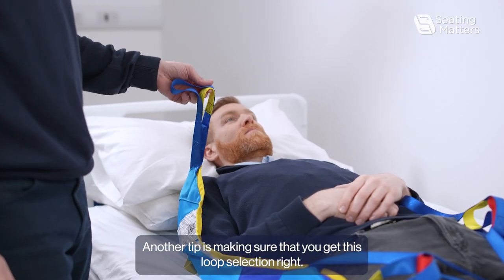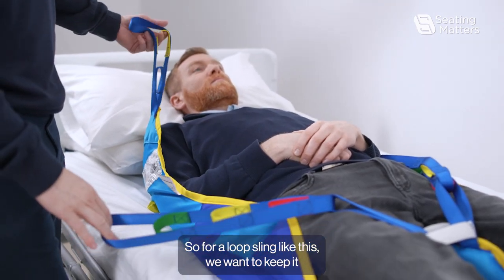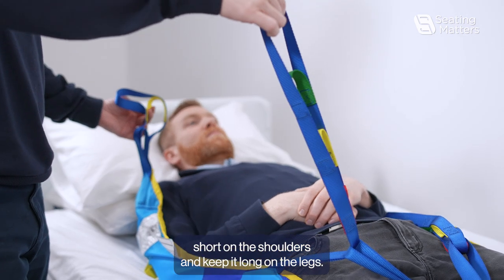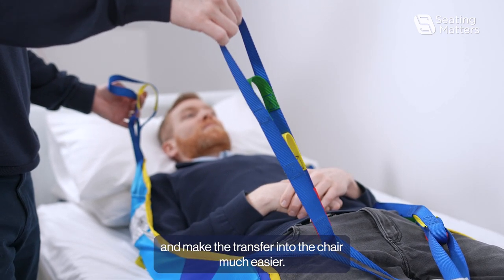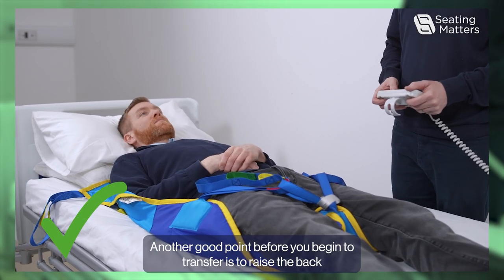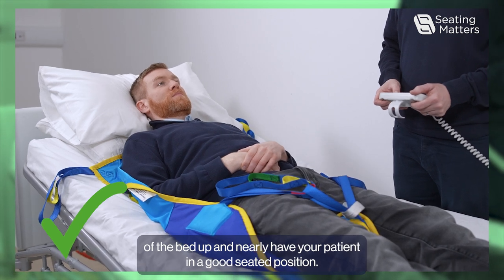Another tip is making sure that you get this loop selection right. So for a loop sling like this, we want to keep it short on the shoulders and keep it long on the legs. That will enable us to get a good seated position and make the transfer into the chair much easier. Another good point before you begin the transfer is to raise the back of the bed up and nearly have your patient in a good seated position.